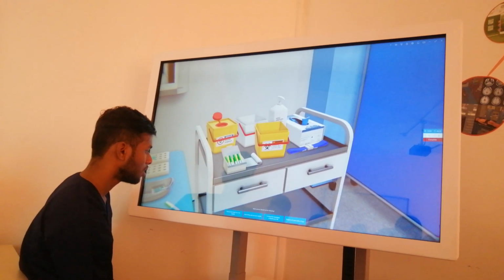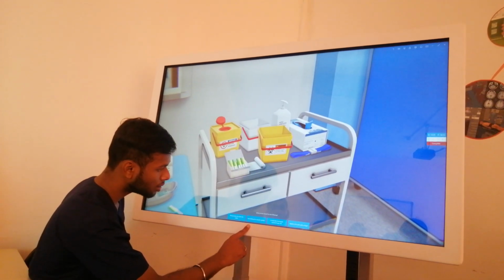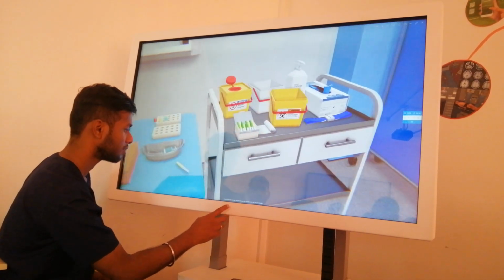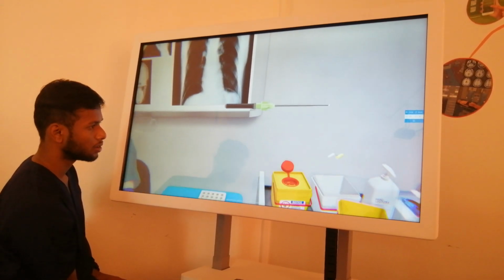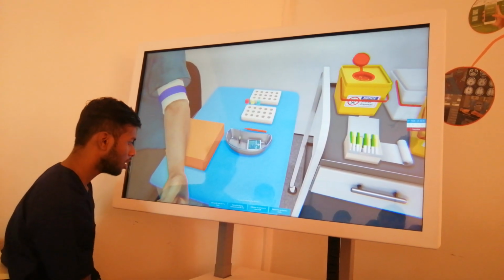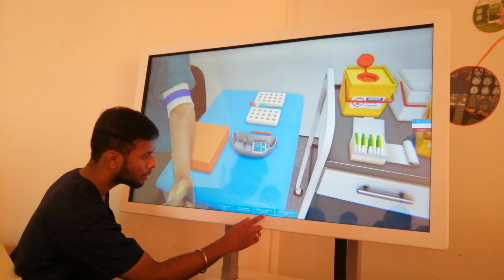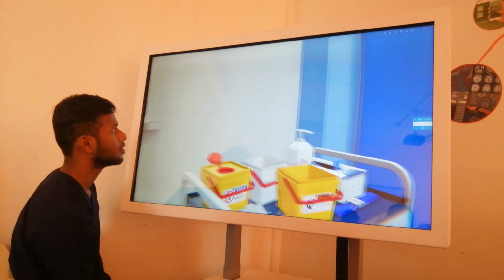What process should be the following? Remove the tube from the holder, assembling the vacuum system. Loosen the tourniquet, unclench your fist, fixation of vein with the fingers. Assemble the vacuum system. Screw the needle into the needle holder. What process should be the following? Remove the tube from the holder, make a few wiggling movements with the tube. Make sure the patient is in good health. Remove the cap from the needle. Remove the protective cap from the free side of the needle.